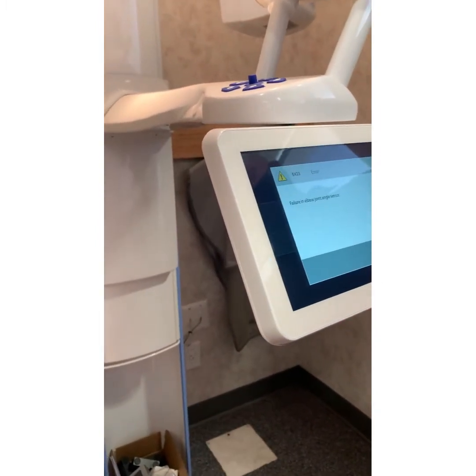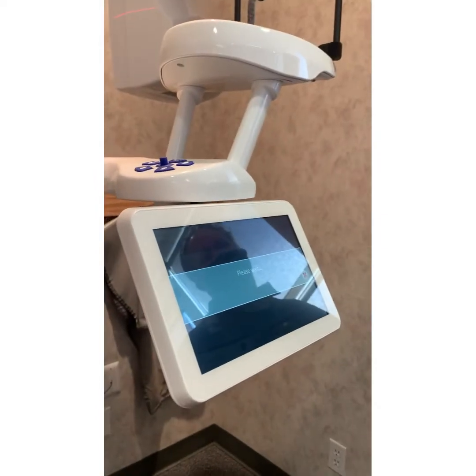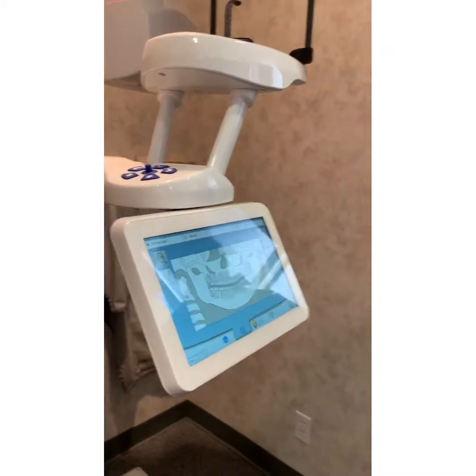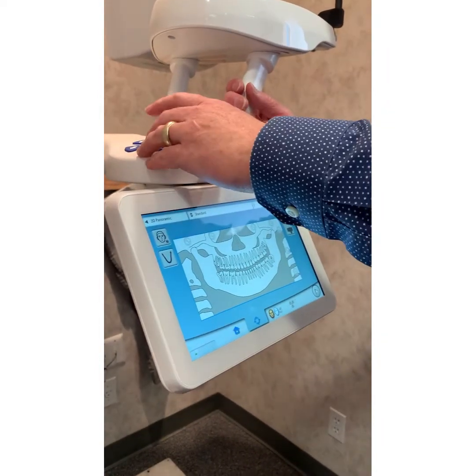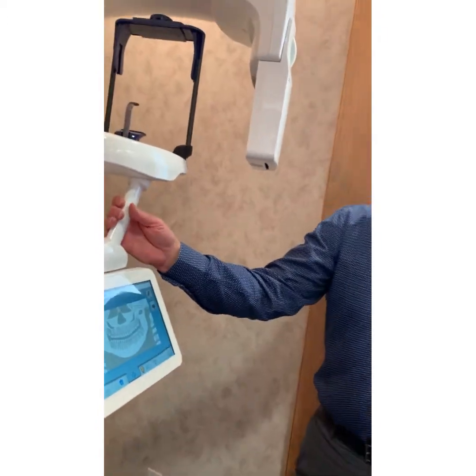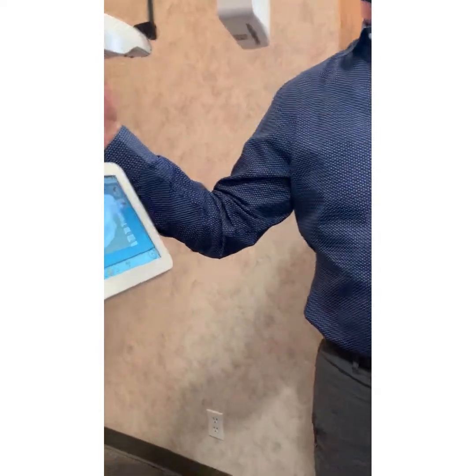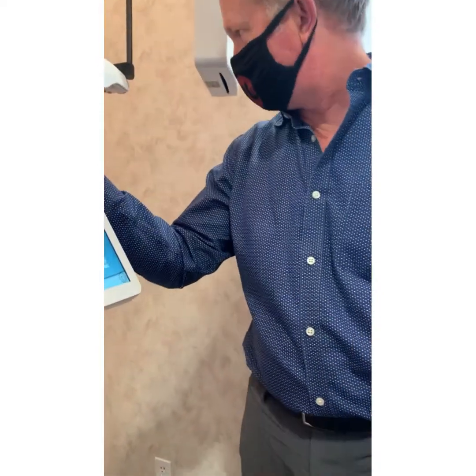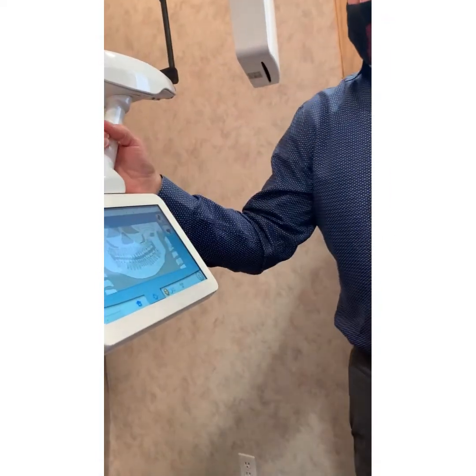Is that gonna be okay? Well, we all know how to correct for that. It just goes in my call Eric file for when I leave. Although Eric did come, he did measure this himself. Okay, good, perfect. I'm still calling him. We're just gonna chat about the buttons and stuff.